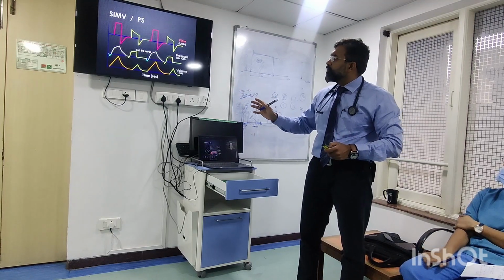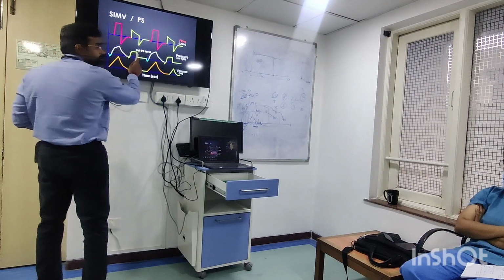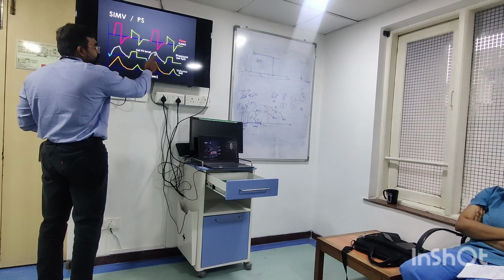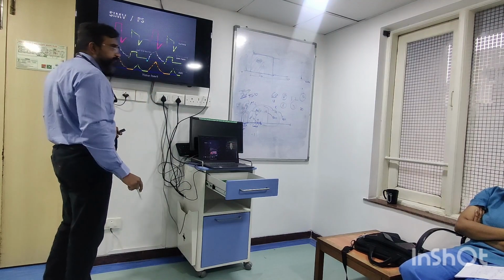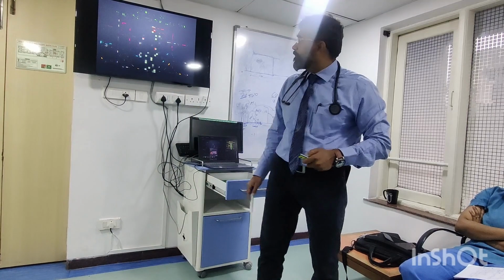Okay? Alright. Now, this is what is SIMV pressure support. Clear? So, in the characteristic, very clearly you have a set pressure support. You have variable pressures coming. These are variable pressures because the volume is constant in the mandatory breath rate. Clear? So flow cycle. This is flow cycling at a set pressure support level. Clear?